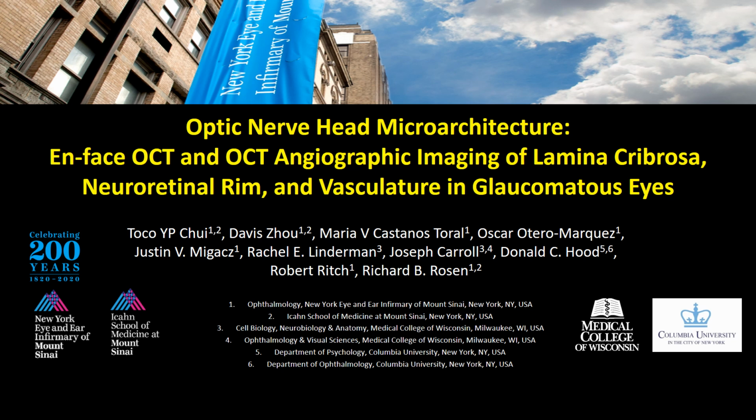I'll be sharing our study, Optic Nerve Head Microarchitecture on en face OCT and OCT angiographic imaging of lamina cribrosa, neuroretinal rim, and vasculature in glaucomatous eyes.